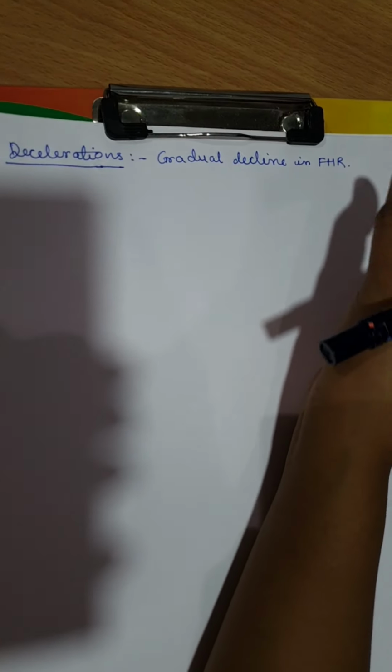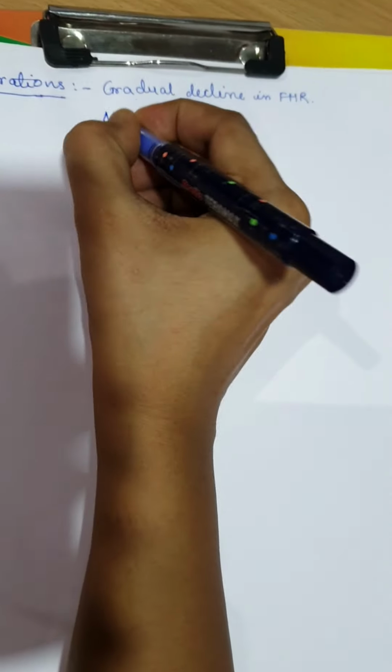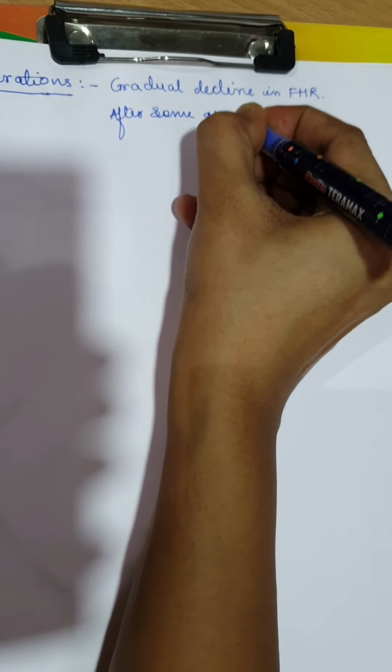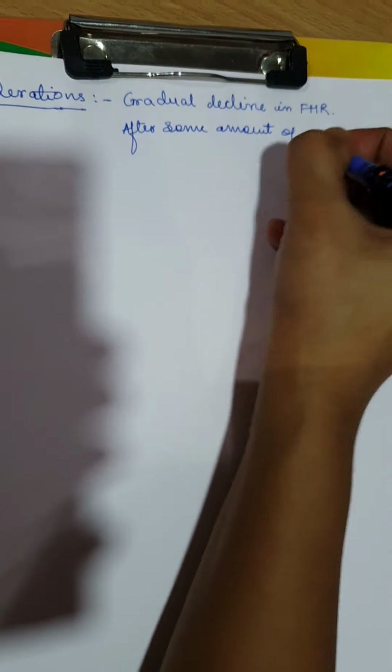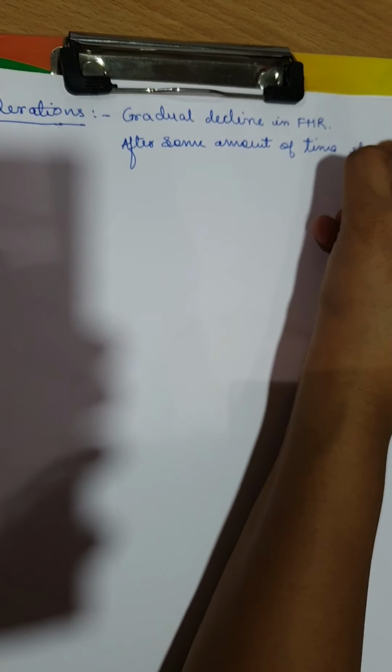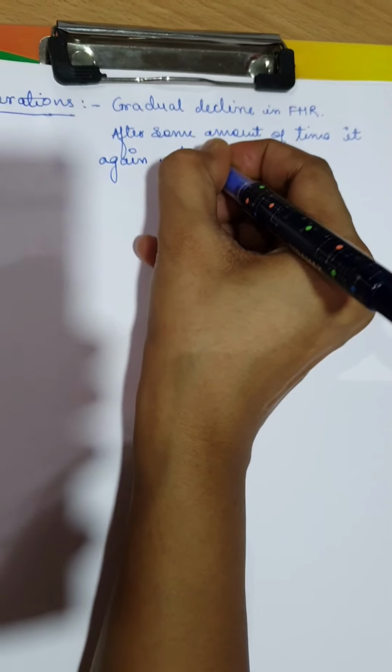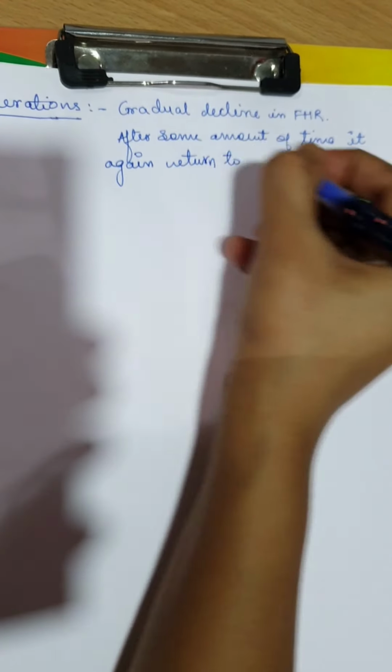And again, after some amount of time or after some seconds, the fetal heart rate returns to the normal baseline.